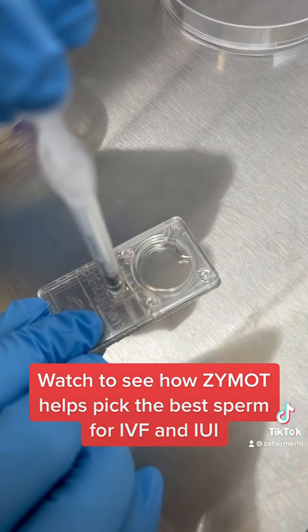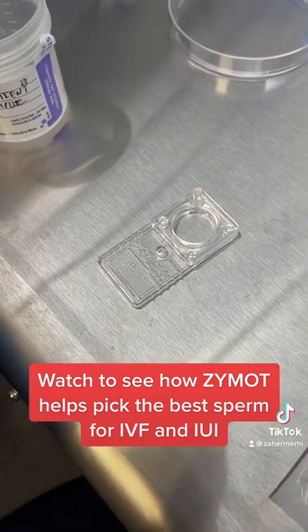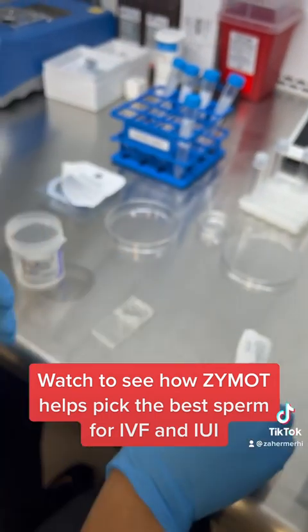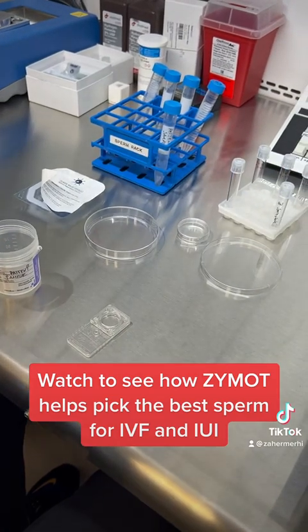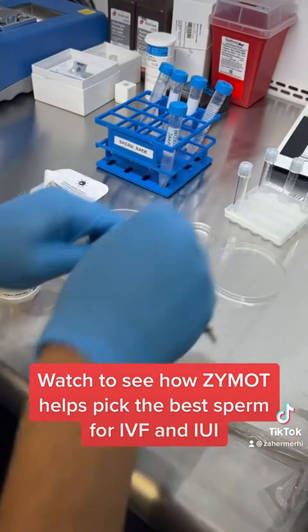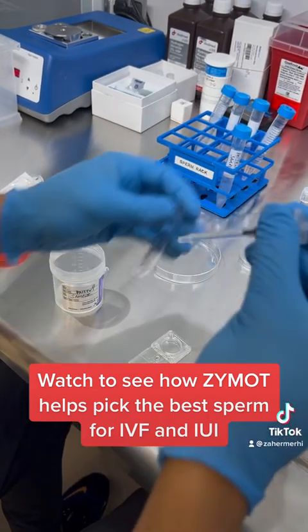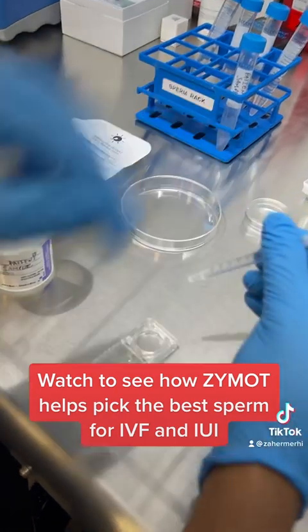Now we incubate for 15 minutes, but we're not going to wait through that here. After incubation, we have to get sperm wash. We're going to take a syringe and take the sperm wash.